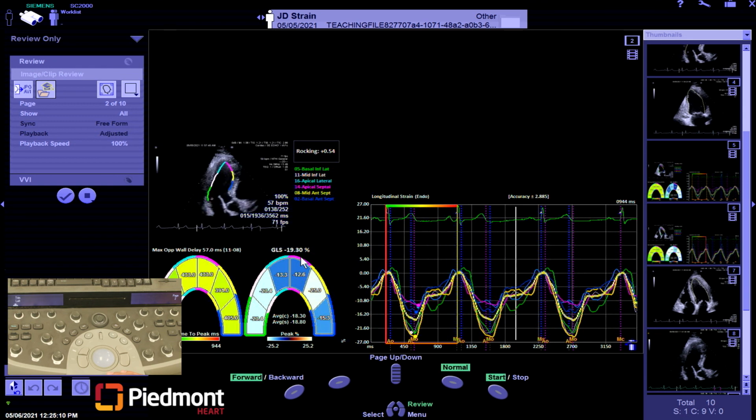And in specific rhythms, such as atrial fibrillation, PVCs, ectopic beats that are in a pattern of bigeminy. Again, for bigeminy, trigeminy, you would not really want to acquire or process any of that data unless, and same with strain, for AFib, unless you can get the patient's heart rate to an ideal consistent R to R interval without a PVC or PAC that affects it.